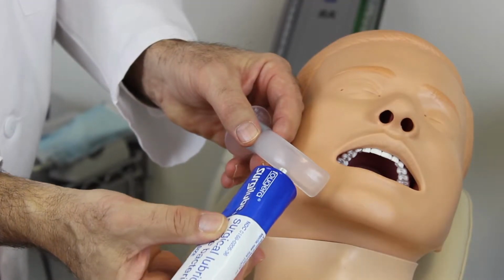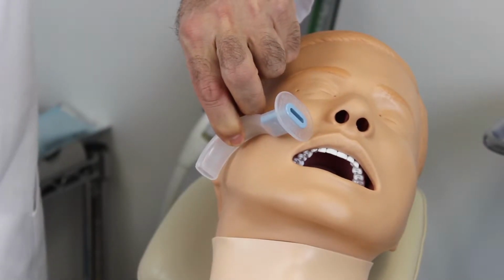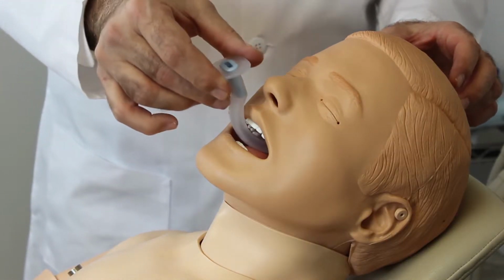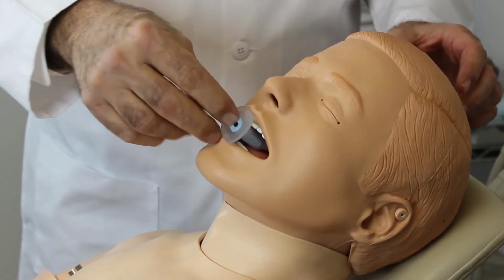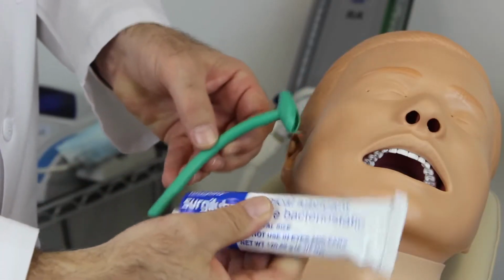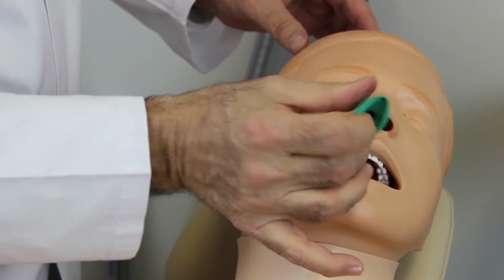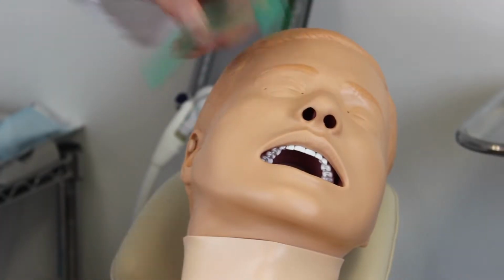This is demonstrated here, and the sizing is shown. The airway should be approximately the length measuring from the lips to the angle of the mandible. It's important not to use too small of an airway, since this could actually push the tongue further back. The nasal airway is placed by placing it through the nares in a direction parallel to the palate. It is sized by measuring the distance from the opening of the nose to the tragus.